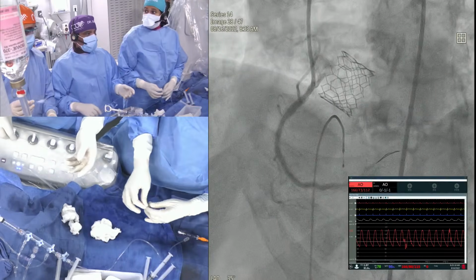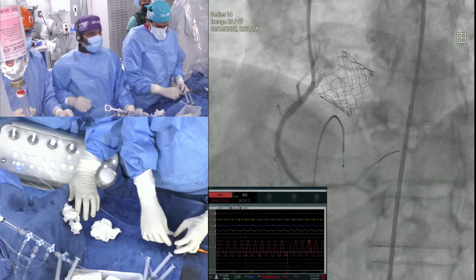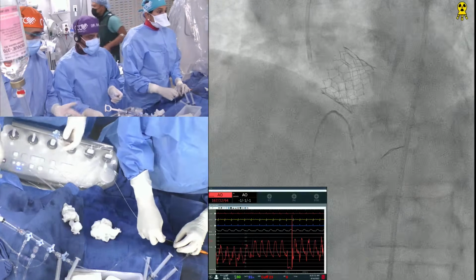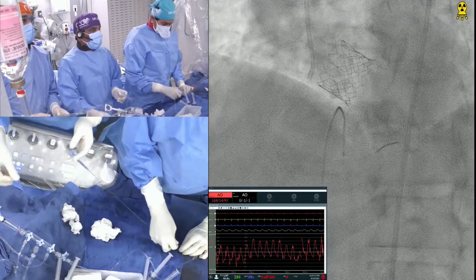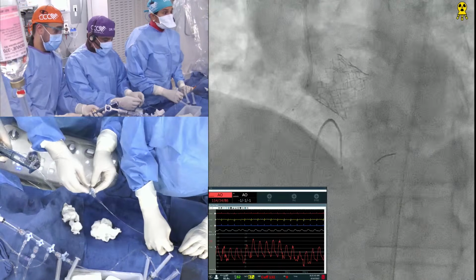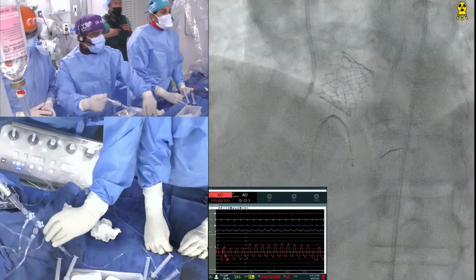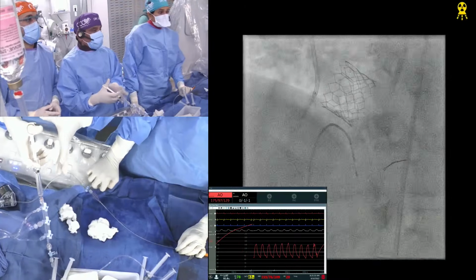Zions SkyPoint 4.5 by 15. And this is the case who has multiple lesions. PCI we have been taking care of for a long time. And of course, with the progression, it's very unusual that a patient has so much progression of the disease after the stent deployment. I understand this RCA got deformed after the balloon expanded because the stent was sticking out, which is okay. But in this particular case, the left main progressed. He developed a non-STEMI, knowing that 5 months ago the ostium of the left main was only 30-50% at the time of the TAVR.